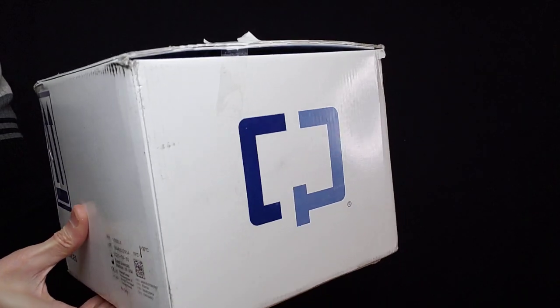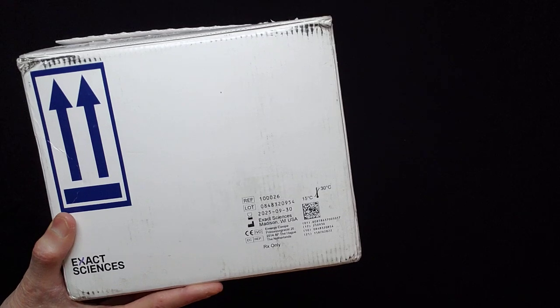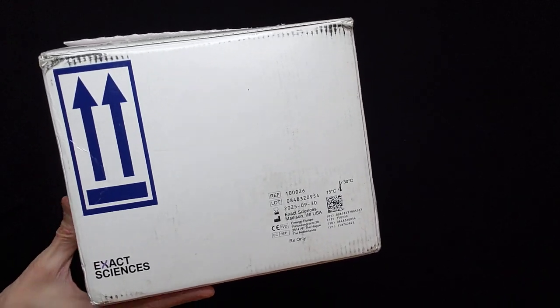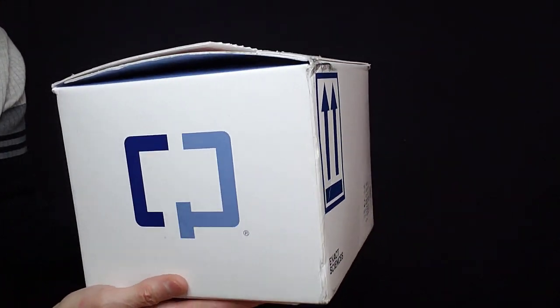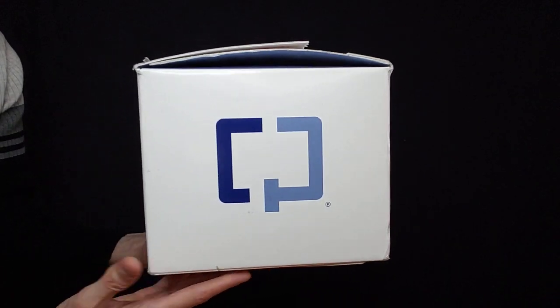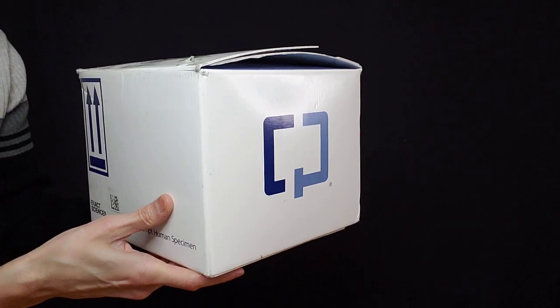This is a test to help detect and prevent early stages of colorectal cancer. This is an at-home screening test that your doctor needs to write you a prescription for. So what I'm going to do, I'm going to set this down and show you what comes in the box.